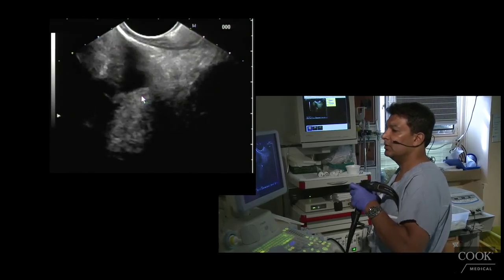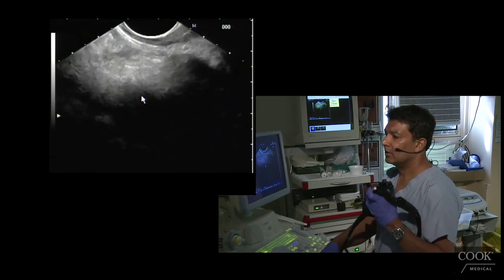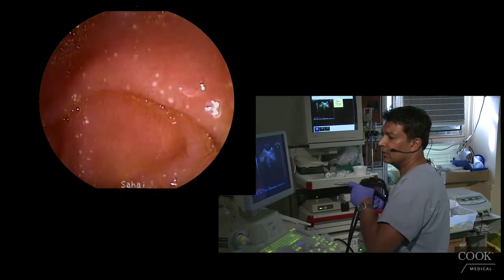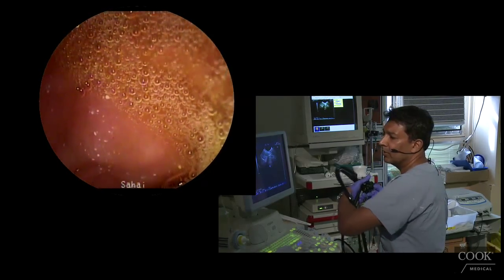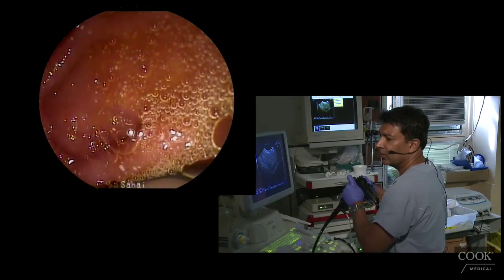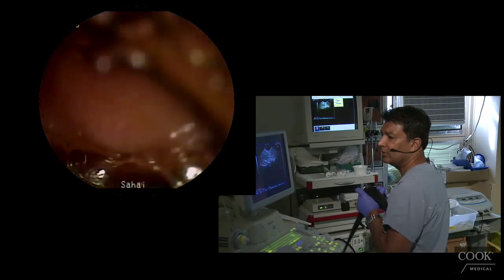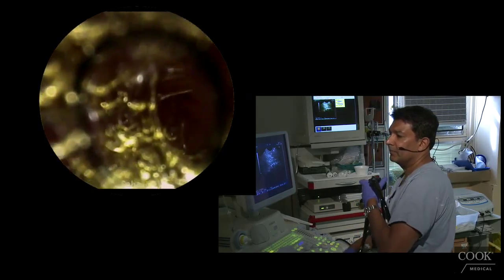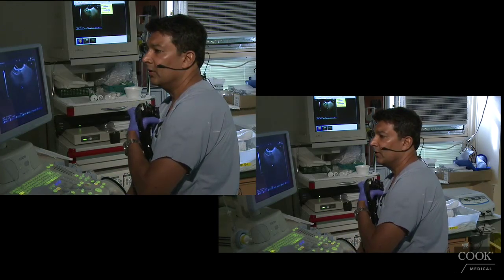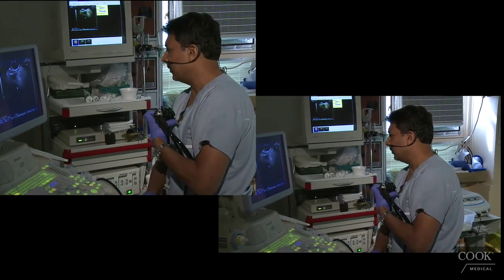Okay, we're going to go into D2. Around the corner. There we go. Keeping the balloon up again, pulling back. There we go. Just wiggling. Again, you don't want to push. Just let the balloon sort of slide its way into D2. And once you're under, then you tip up, max up and pull back.